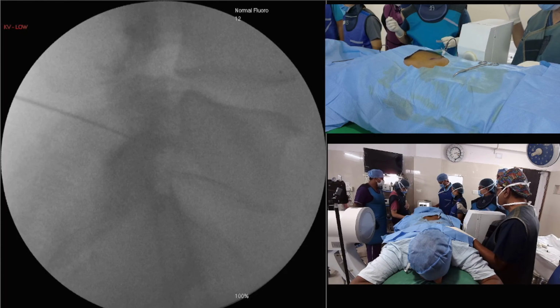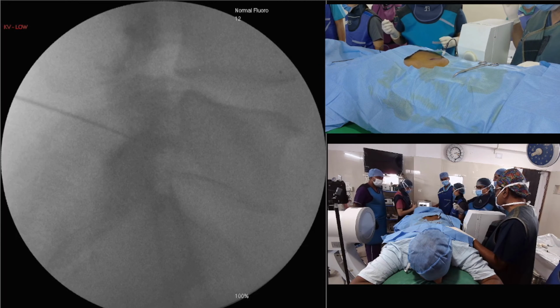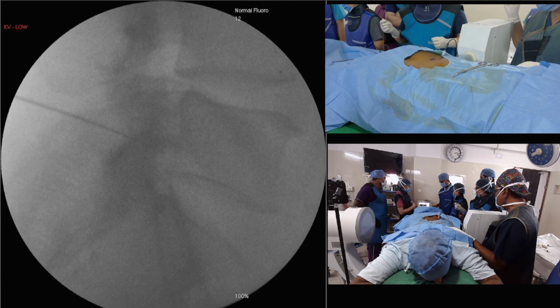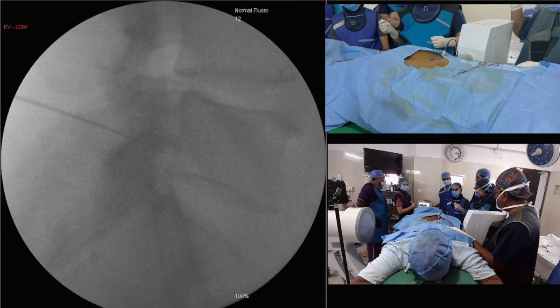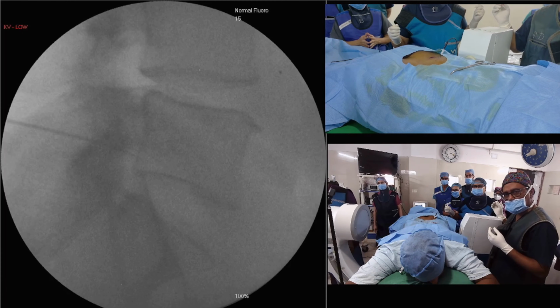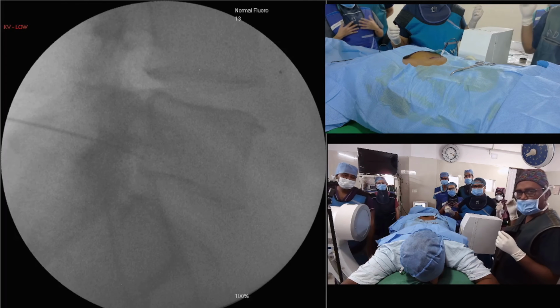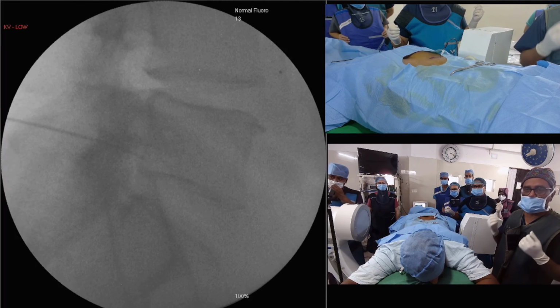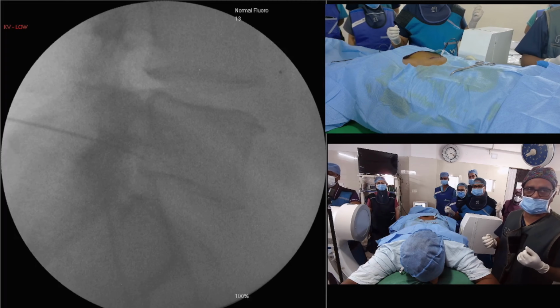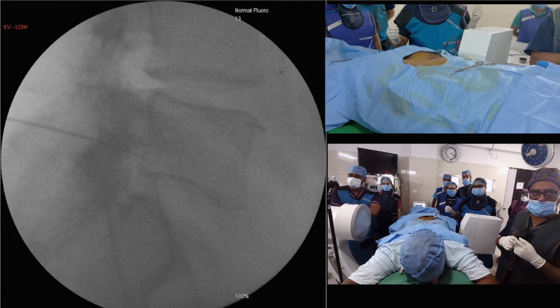After appropriate needle position, do sensory stimulation and ask the patient for paresthesia along the nerve distribution. Insert the needle further till the patient experiences paresthesia. Basically, I am almost touching the bone. Normally it comes in the posterior surface, but the anatomical location always varies. So the best thing is you have to elicit the paresthesia. Till you are getting the paresthesia, understand that you are not sufficiently close to your DRG.